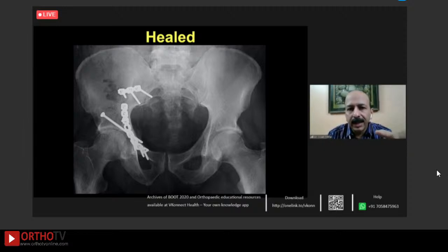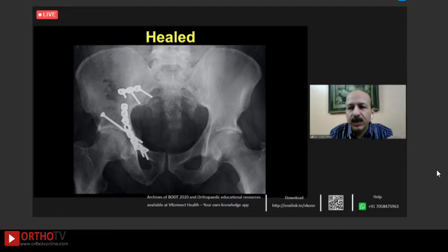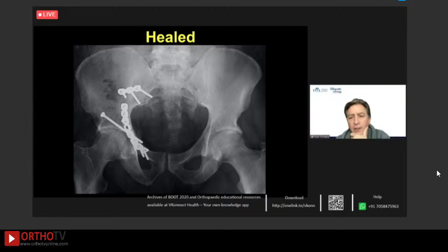So I think that a lateral window with a Smith-Peterson combined with an osteotomy is going to give you that entire exposure of all the dome area which you want here. And maybe if you want another clamp from that place, we can still get it. So I usually used to use ilioinguinal, but for many of these fractures, because they are so lateral to the iliopectineal eminence, I feel like many of them can still just come out with osteotomy and Smith-Peterson and not go through the inguinal ligament. Right. And so your second clamp would just be on the anterior part of the acetabulum under direct vision.